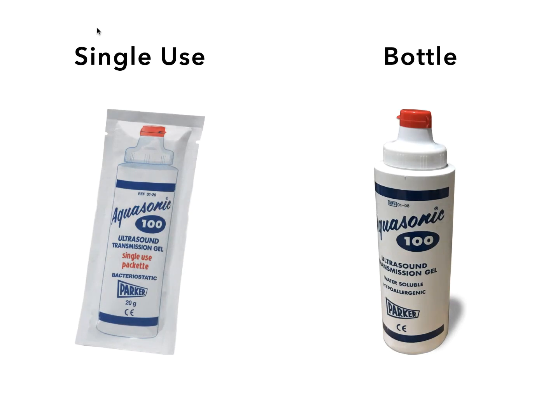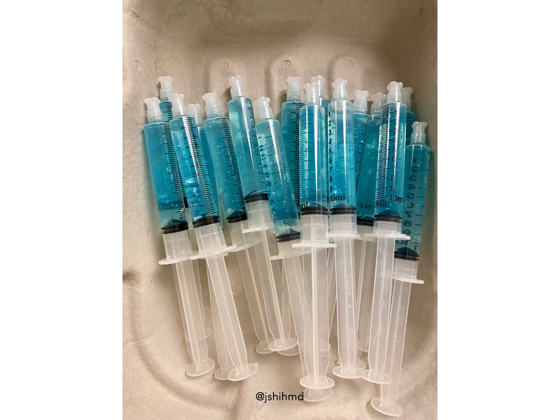You should utilize single-use gel packets instead of bottles. A bottle of gel is too high risk from an infection transmission standpoint. If you don't have single-use gel packets, here's a hack where you can make your own single-use gel dispensers with 10 cc syringes.